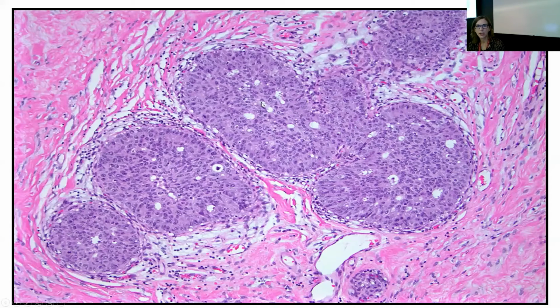Here's another challenging case. This was actually called atypical by the original pathologist, sent for a second opinion. That pathologist called it usual ductal hyperplasia, and we received it for a third opinion. And I think this one's tricky. It looks like maybe there's some rounding of the spaces, but there's not perfect polarization around the spaces. The nuclei look a little bit variable maybe.